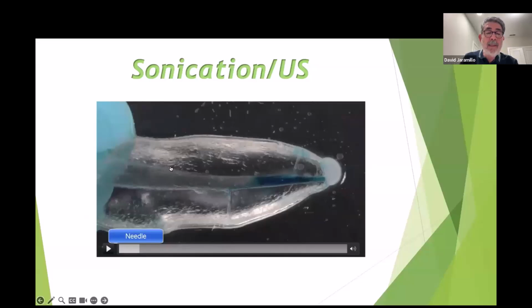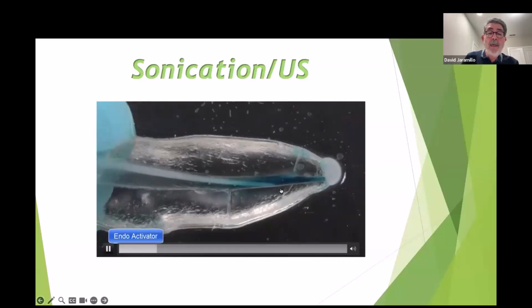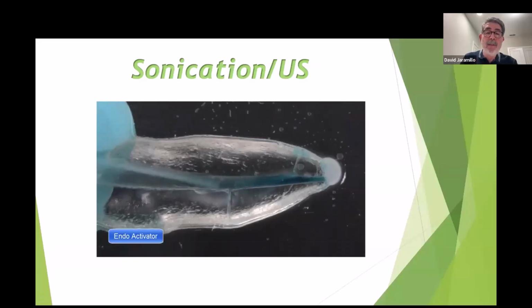As soon as the tip has contact with two surfaces, basically the effect is shut down. We're gonna see here. See how the tip is vibrating, and as soon as it has contact here and here, it stops the vibration. We don't see anything happening here. And this is exactly what happens with ultrasonic.